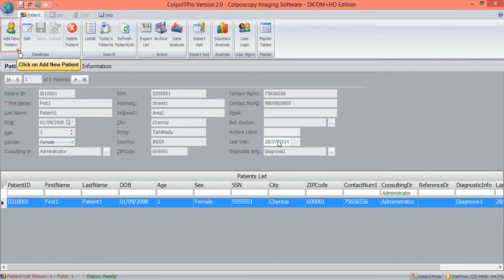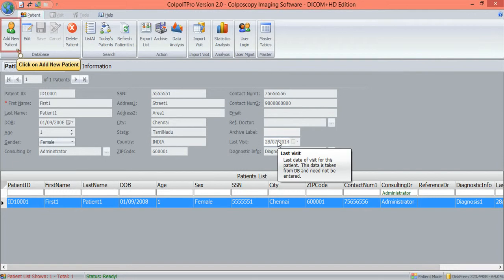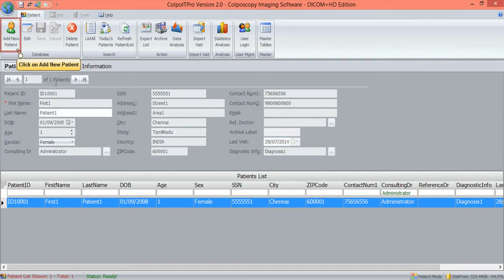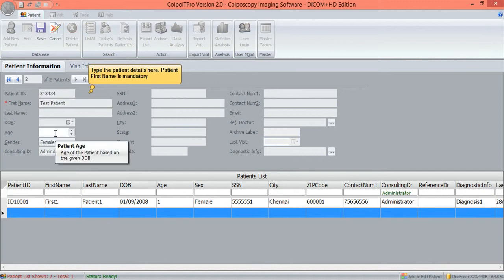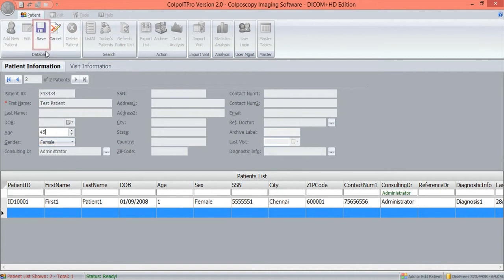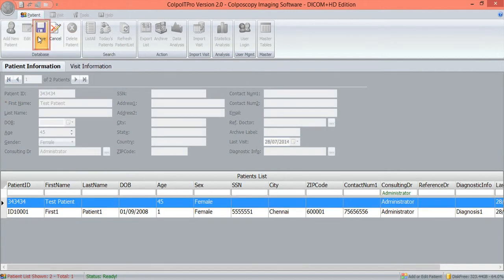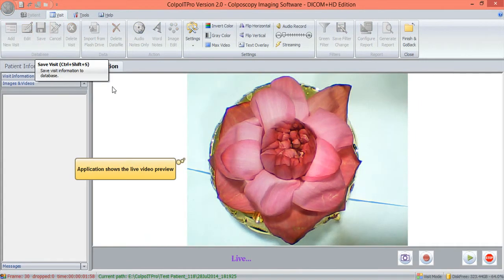In the Patient Information screen, click on Add New Patient. The user adds a new patient by keying in the first name of the patient, which is a compulsory field. Other data can be added later as they are informative during reporting and for future references. Save the patient data and move into the Visit Information window.